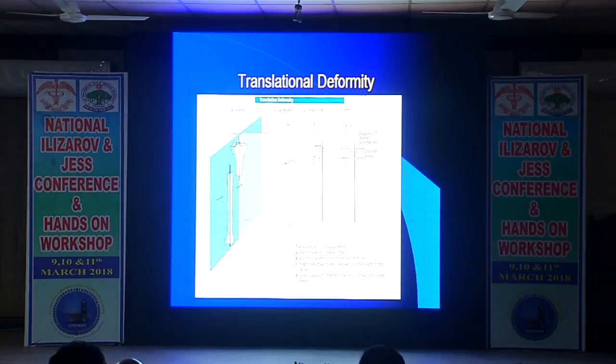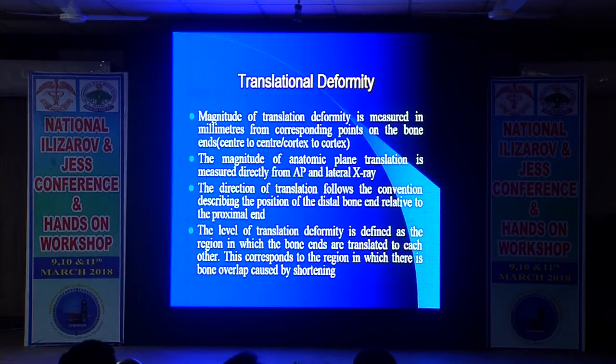Again, what I just described earlier is shown on this translational deformity. It tells you the plane, the direction, the magnitude, and also the level. That is a summary, and all this can be measured from the X-ray.